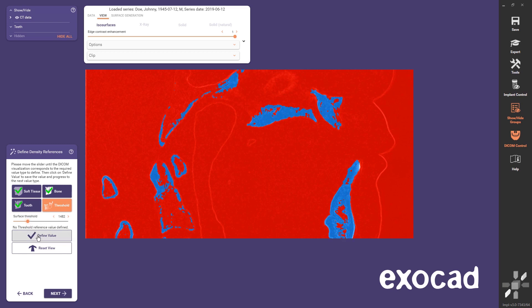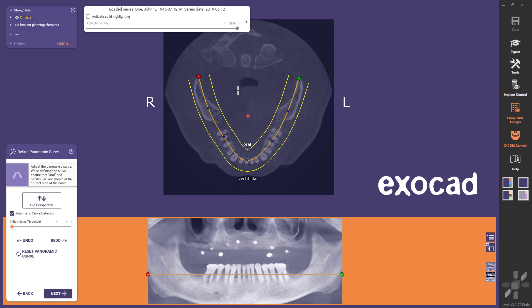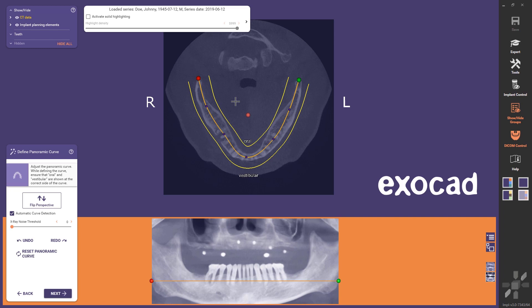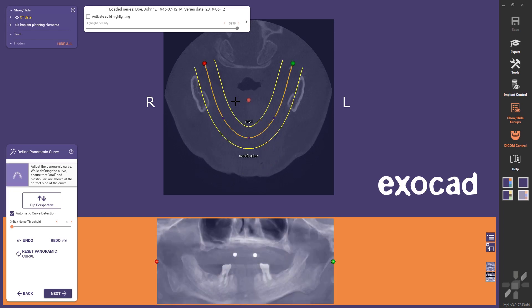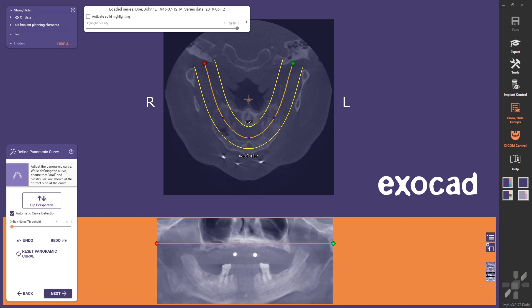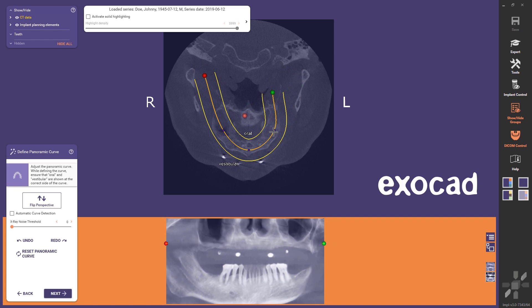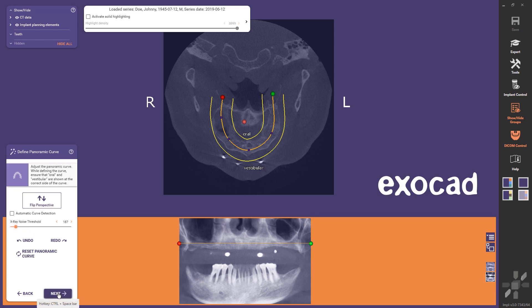When the values are defined, the software automatically continues to the next step, which is the panoramic curve definition. Exoplan now automatically defines a curve, and as you can see when I scroll through the slices, it finds the best curve in the current slice. If the software does not find a nice curve due to lack of data, it presents a default curve. I can change the curve by moving or adding points as usual. I'll change the noise threshold a little bit and continue with next.